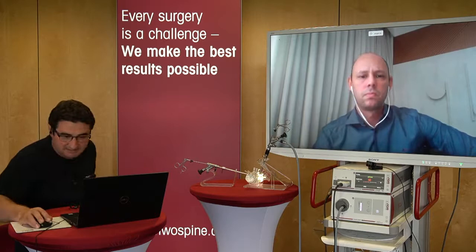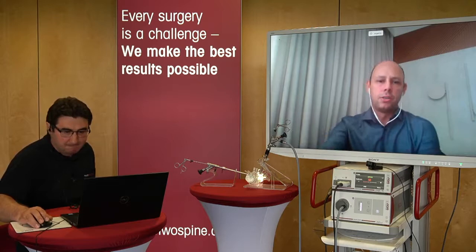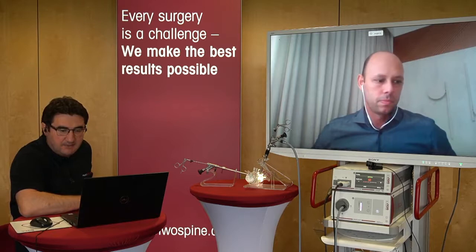Do you use steroid intradiscally or periarticularly after the operation? Only at the end of the surgery. I put in my working sleeve, I do a sleeve maneuver, remove the fluid, and put my steroids into the canal. Only this. Okay.